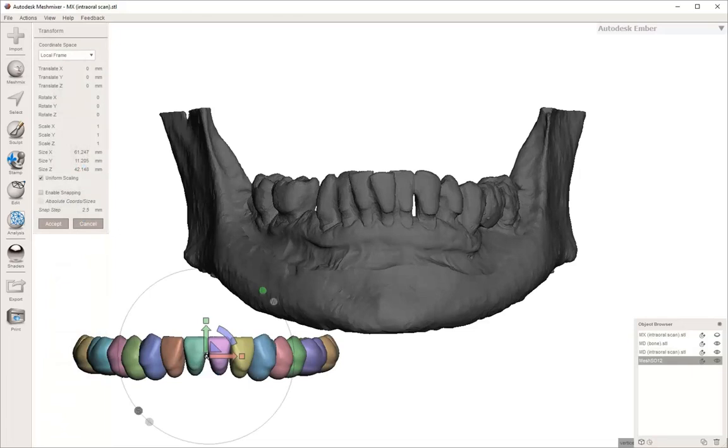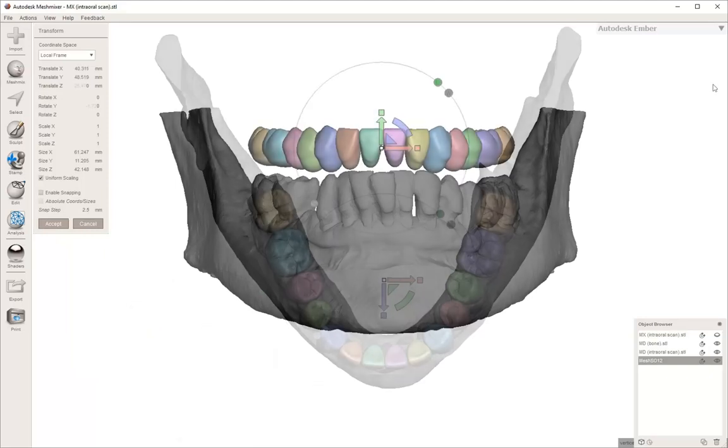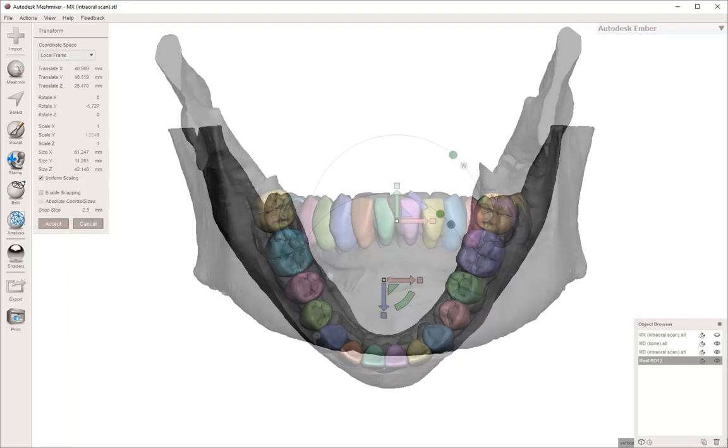Once you have that full set of mandibular teeth, you're going to start moving them using the transform tools by moving them right to where they're supposed to go. You're going to look at it from all different angles, from the frontal, from the side, and from the occlusal.